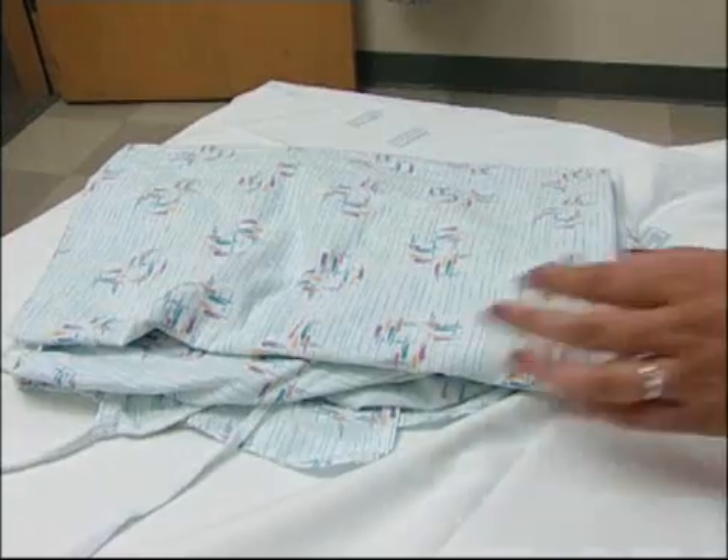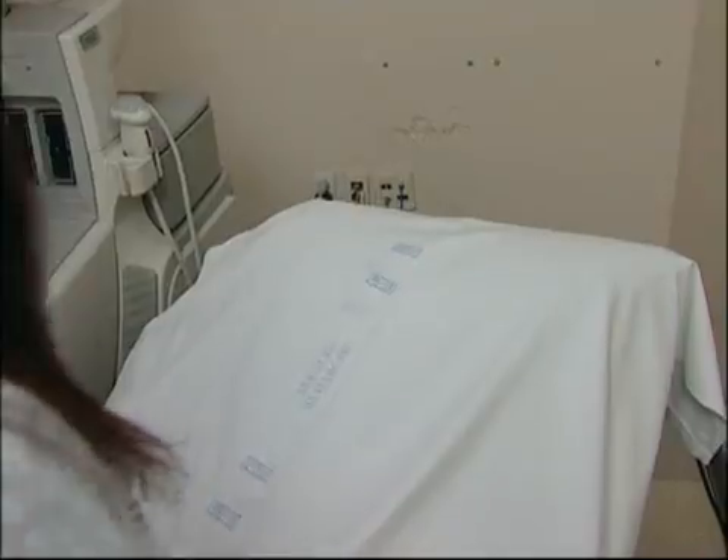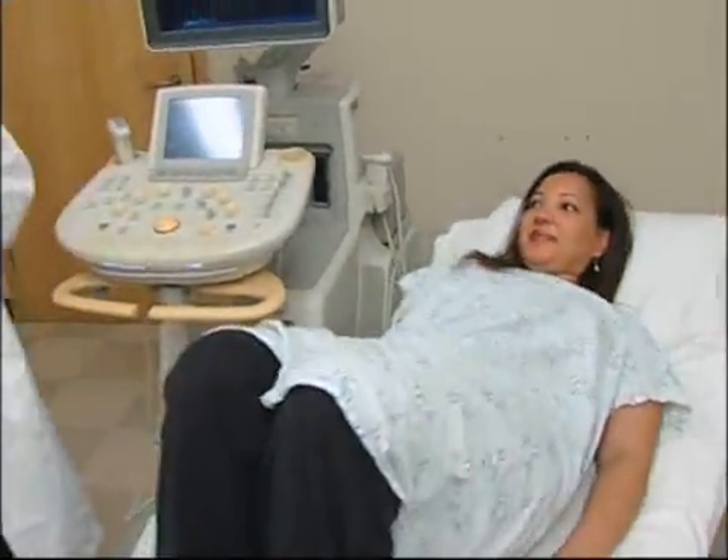What we'll be focusing on today is your gallbladder and your liver. To prepare for an ultrasound, patients change into a gown or hospital scrubs.